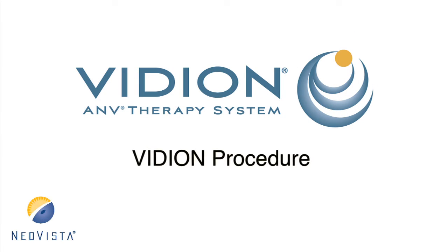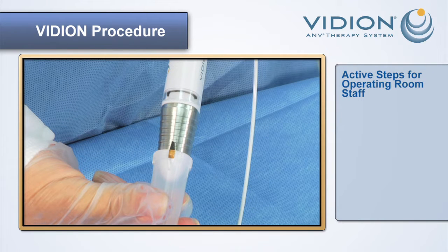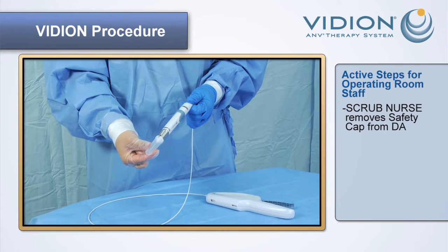VIDION procedure. Active steps for operating room staff. The scrub nurse removes the plastic safety cap from the disposable applicator.